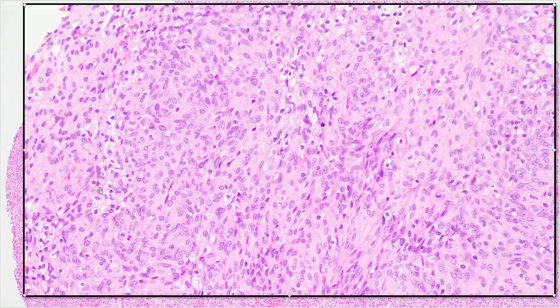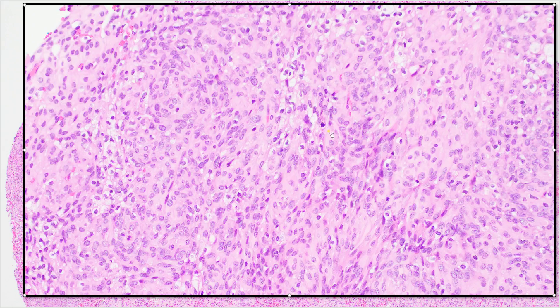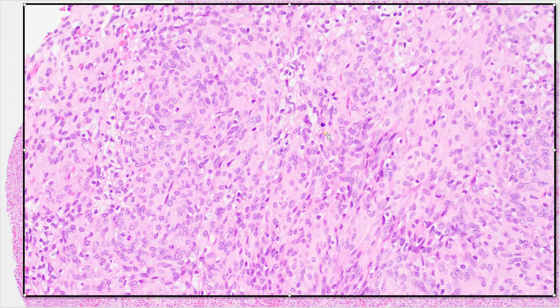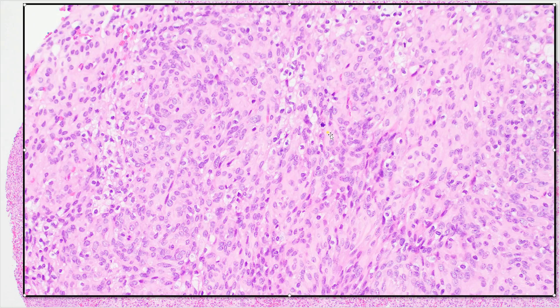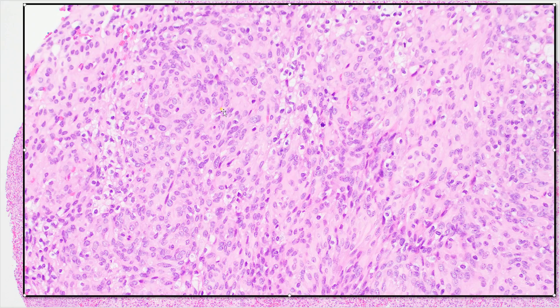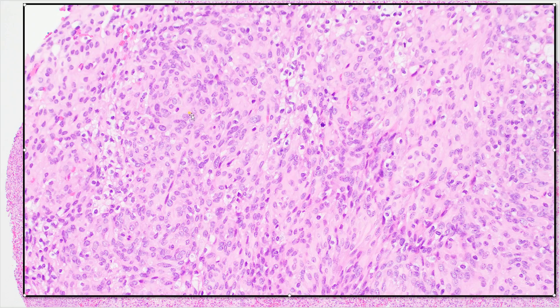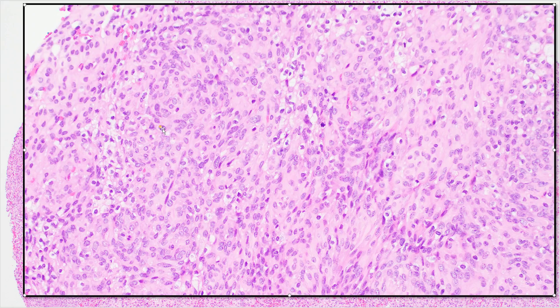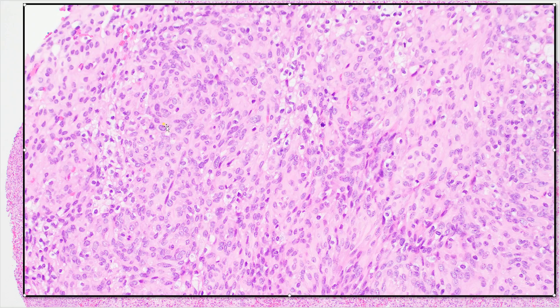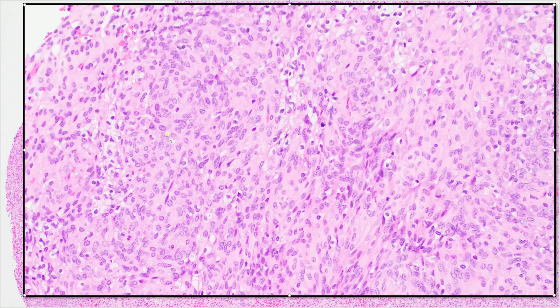In addition, there are a few little macrophages here and there, and there's a mitotic figure right there. In general, we see that there is a syncytial appearance to the cytoplasm. The cells have round, egg-shaped nuclei, and this is a very classic appearance of meningioma.